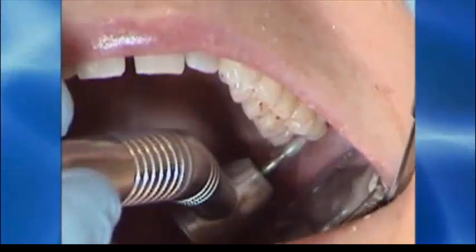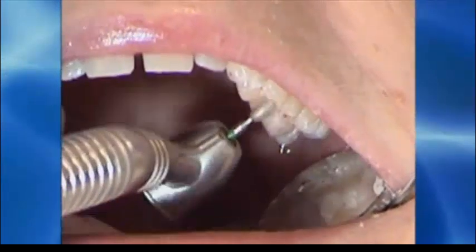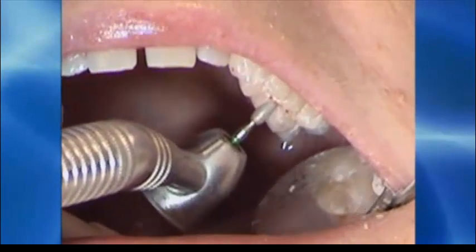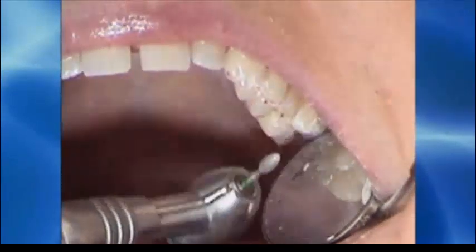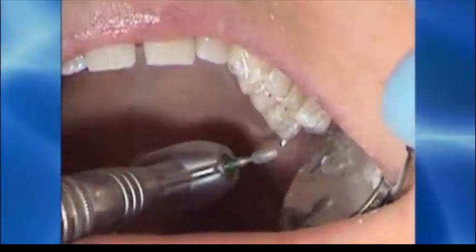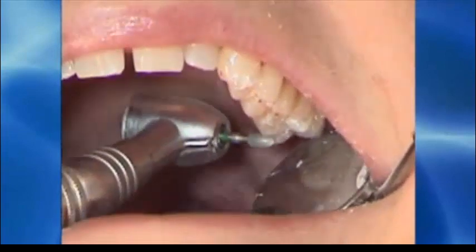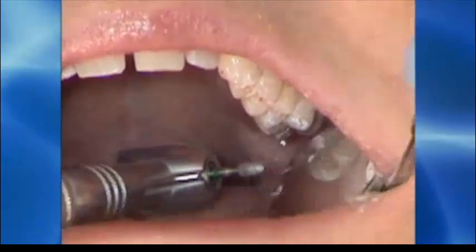After remarking the teeth in the same fashion as before, with the patient sliding in both directions from their MIP, I'm now trying to remove the last little bits of friction, any kind of drag that we see on the teeth, any linear contacts. And notice that I'm just lightly touching the teeth with the burr, cleaning up around the contacts that I wish to keep. You can see two of them in the central fossa of the first premolar and second premolar.